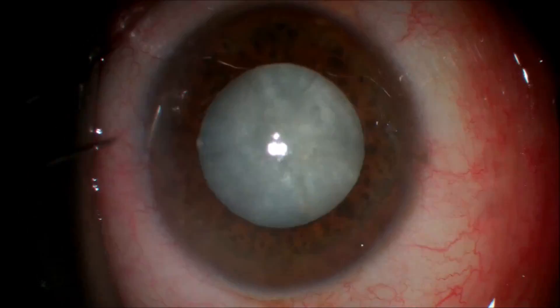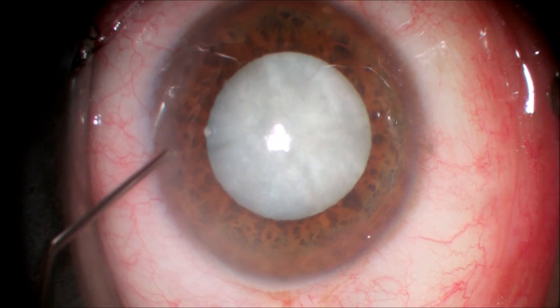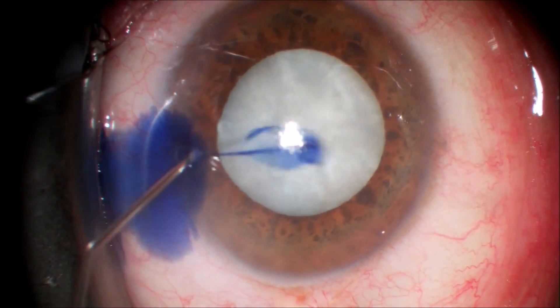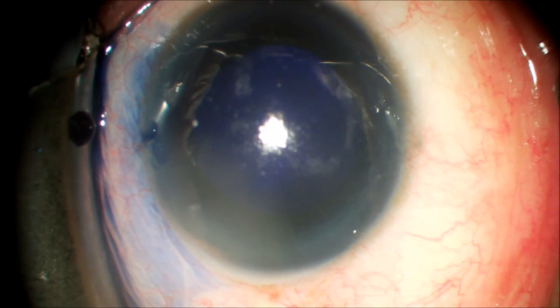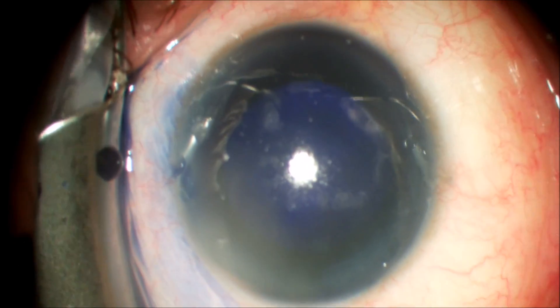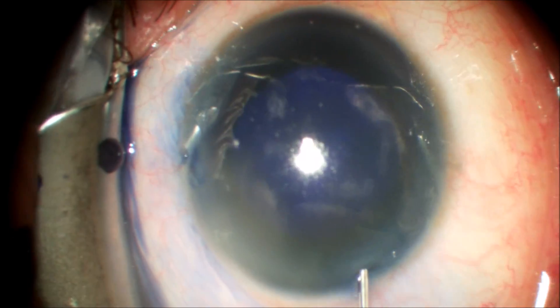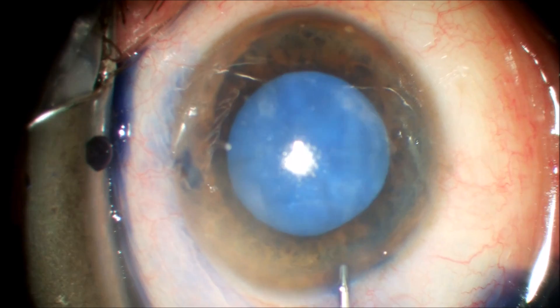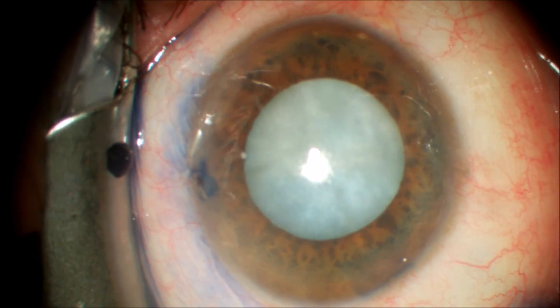We construct our single plane incision and we're going to inject the trypan blue in the side port. You can see this fully fills the anterior chamber and will stain the anterior capsule. After we remove the excess trypan blue with balanced salt solution, you can see how easily this is removed from the anterior chamber.